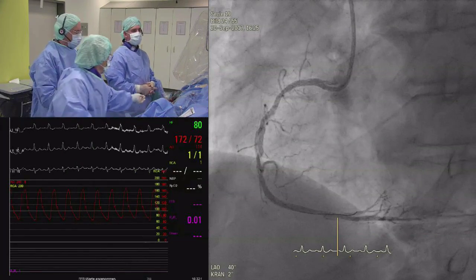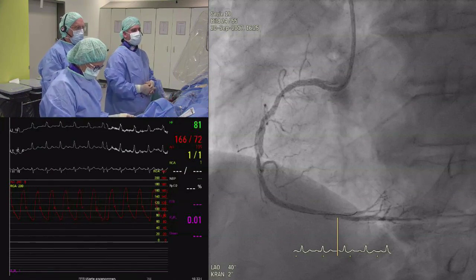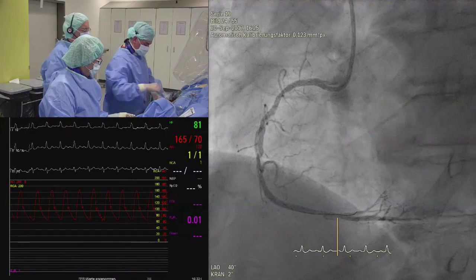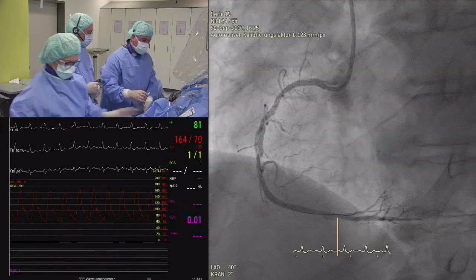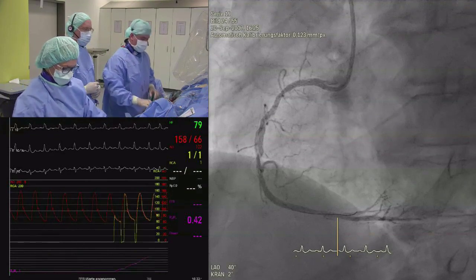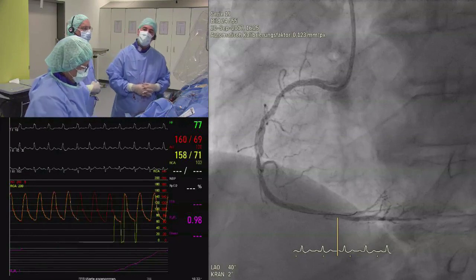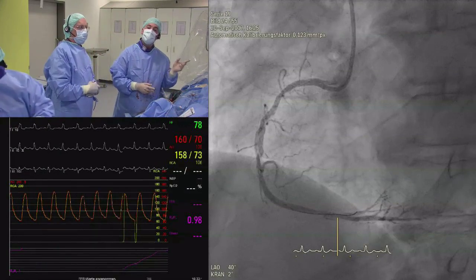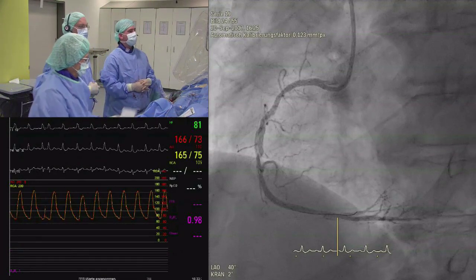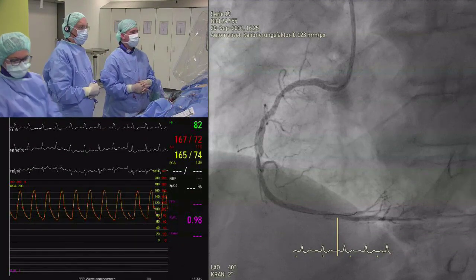Yeah, true. Just for the sake of this teaching course, would you be measuring FFR now after ballooning before stenting, to show how much of the hemodynamic consequence of this lesion has been taken care of? I think most. We can do that. Basically, that was what was mentioned by Dr. Matsuo, when you use the balloon, that's with hyperemia. Absolutely, so you know exactly. And I would like to duplicate this with adenosine immediately after, to see that the hyperemia caused by balloon inflation is already almost maximal. Yeah, let's do the measurement actually.